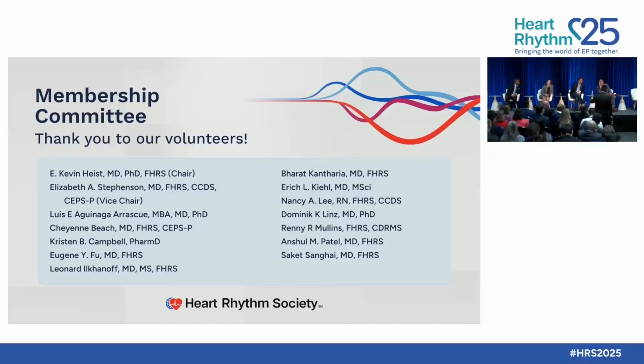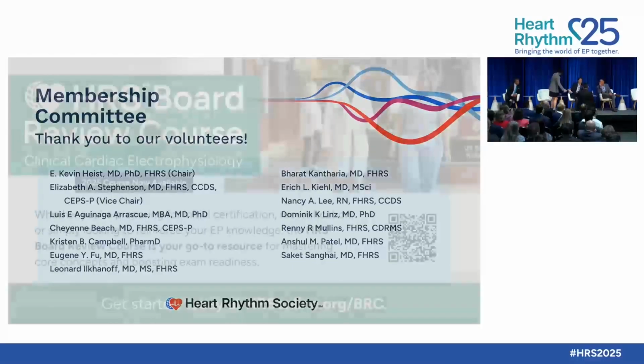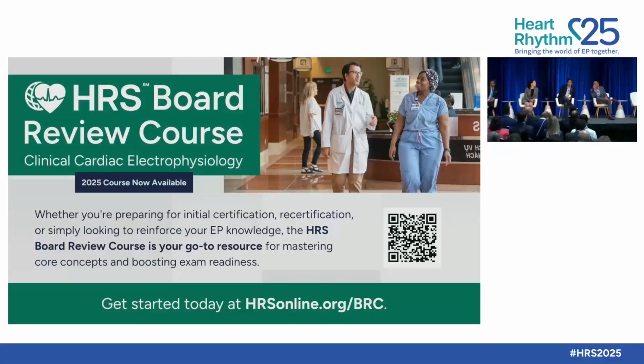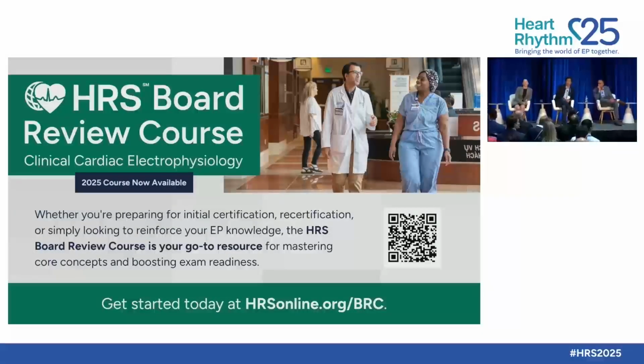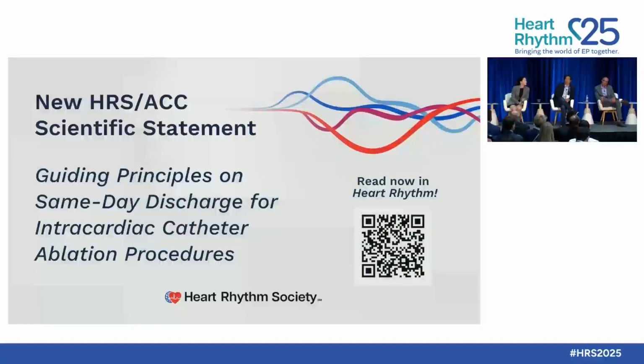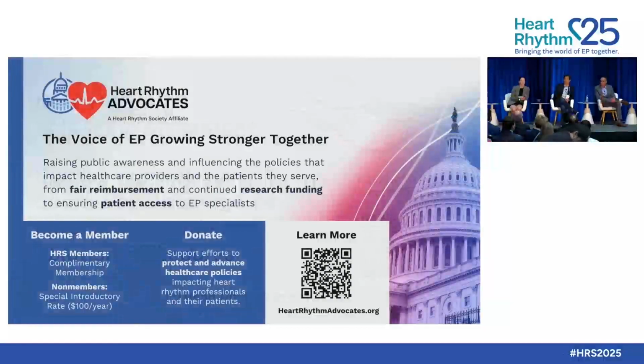Let me just clarify one thing: my case was actually posterior wall isolation. I can just speak in general terms, but when you look at the tailored data and the distribution of where dispersion is located, it's not all in the anterior wall, actually. In fact, there's a reasonably even distribution between the anterior wall, the interatrial septum, which is actually quite a big player, and the ridge and vein of Marshall area. The posterior wall, surprisingly, is not as much as you would think. It's a pretty low percentage, and then the right atrium too.